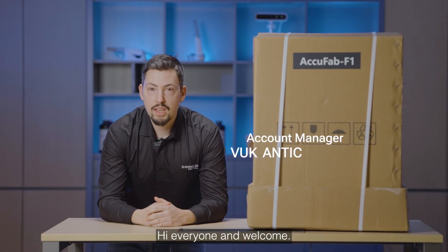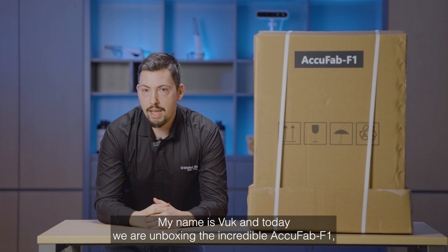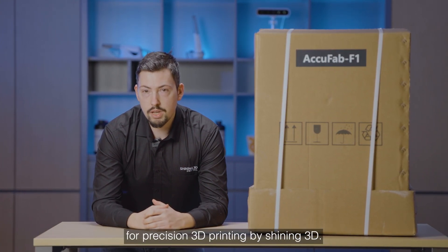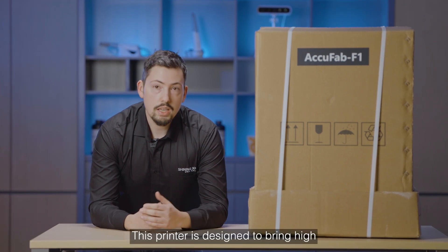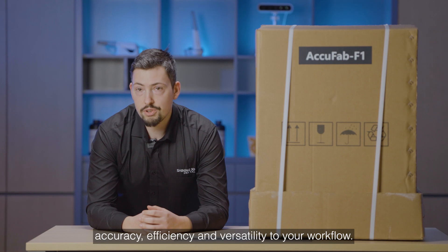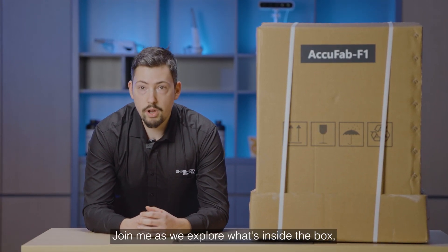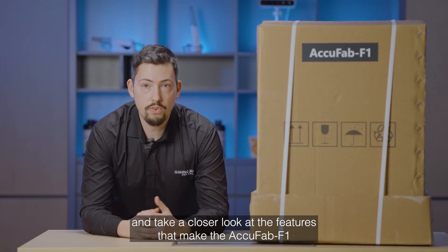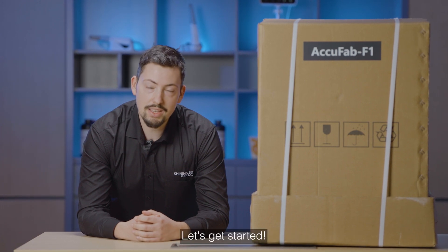Hi everyone and welcome. My name is Vuk and today we are unboxing the incredible AccuFab-F1, the latest cutting-edge solution for precision 3D printing by Shining3D. This printer is designed to bring high accuracy, efficiency and versatility to your workflow. Join me as we explore what's inside the box and take a closer look at the features that make the AccuFab-F1 a standout choice for professionals. Let's get started.